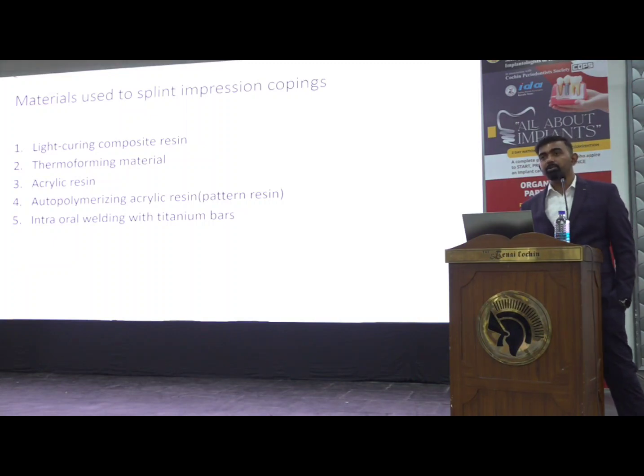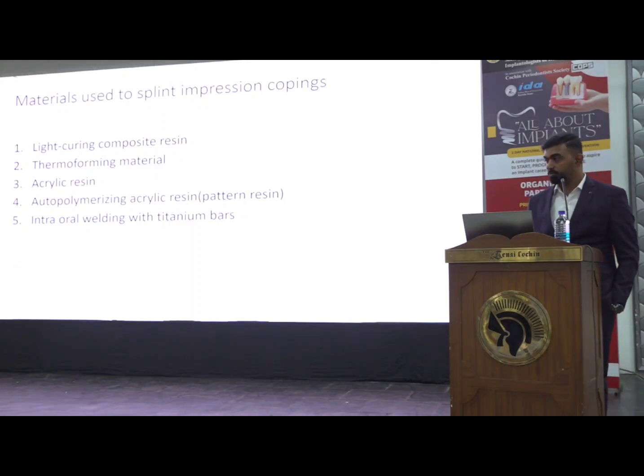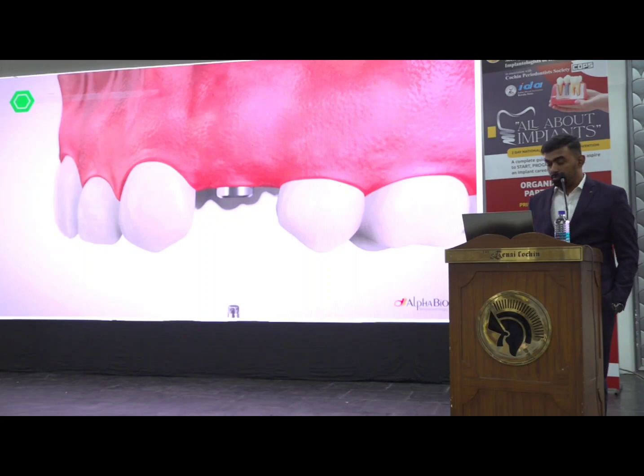Nowadays, with the help of welders, titanium bars are also being used. And I will play a video of the open tray impression technique.